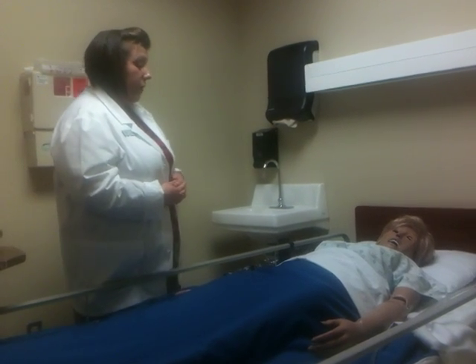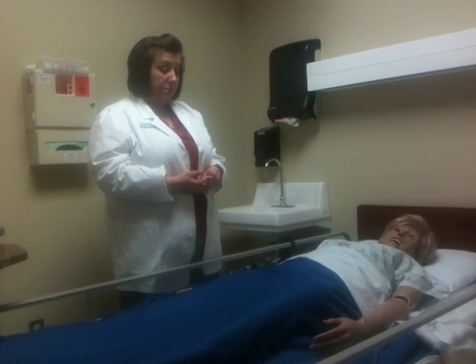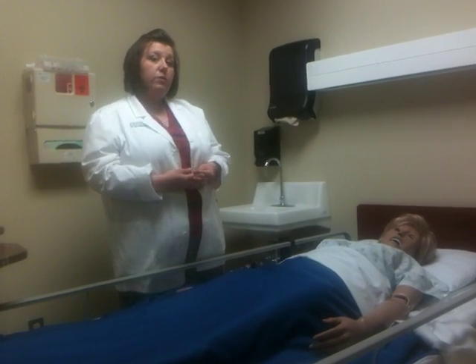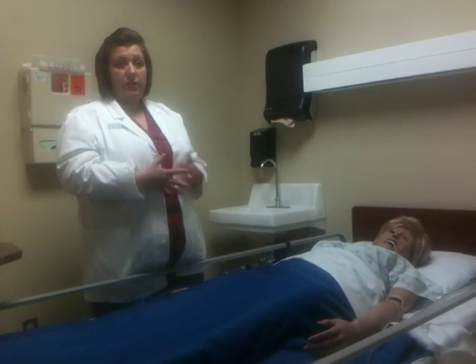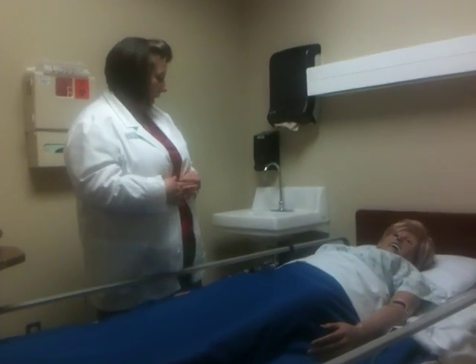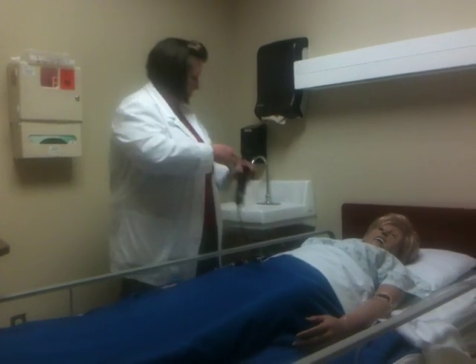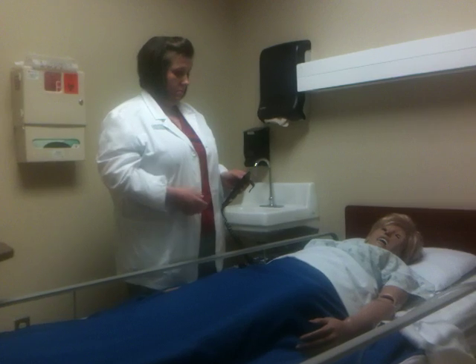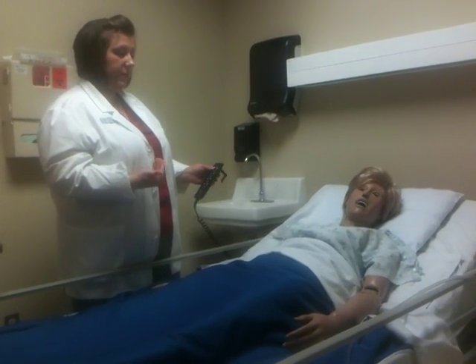Okay? And go ahead and tell her what we're going to be doing. It's going to be a little bit uncomfortable. It's going to go in through your nose, down through your throat, into your stomach. But it is going to relieve your nausea and help you feel better. Okay? So at this point, I'm going to go ahead and put her head of her bed up. She needs to be in a high Fowler's position because of the risk of aspiration.